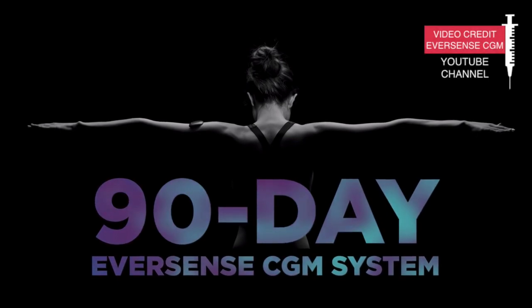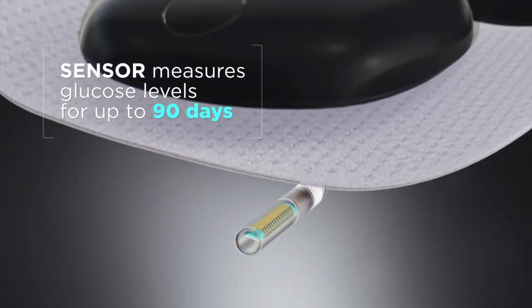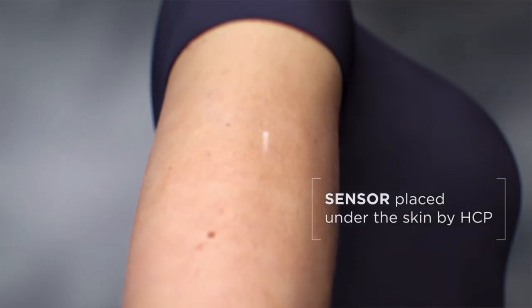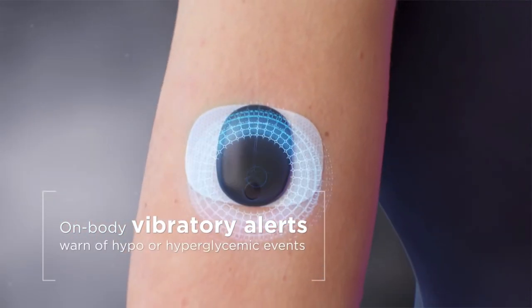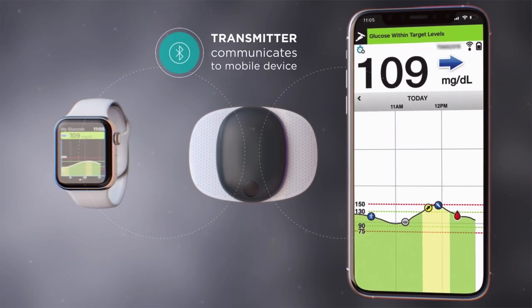They currently have two CGM solutions: the 90-day Eversense CGM system and the 180-day Eversense XL system. Both systems consist of the first ever subcutaneous sensor that measures glucose levels for up to 90 or 180 days, a removable and rechargeable smart transmitter that provides on-body vibration alerts, and a mobile app for long-term continuous monitoring showing your glucose value and graph.